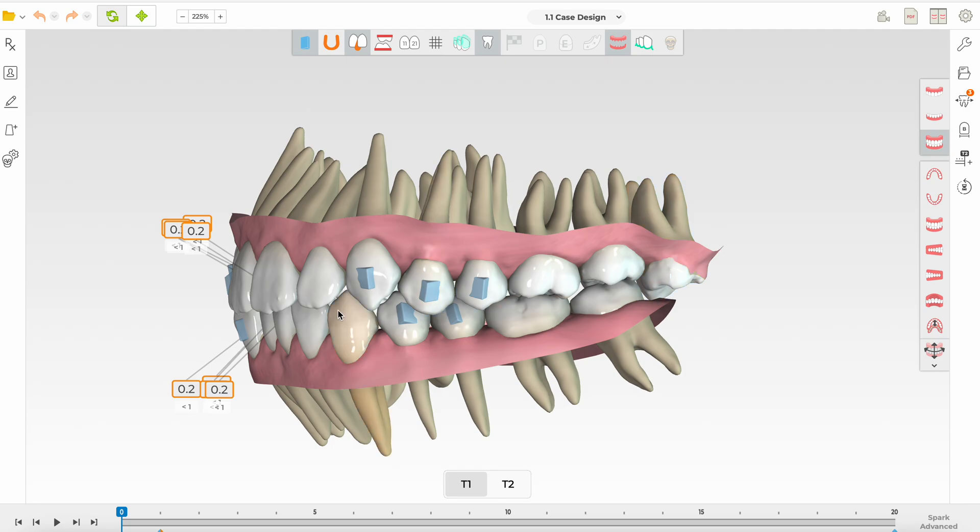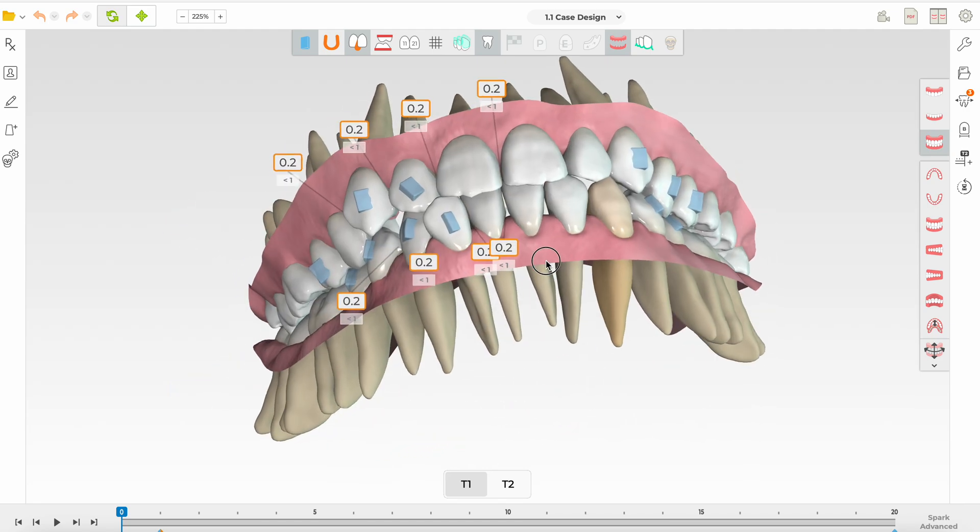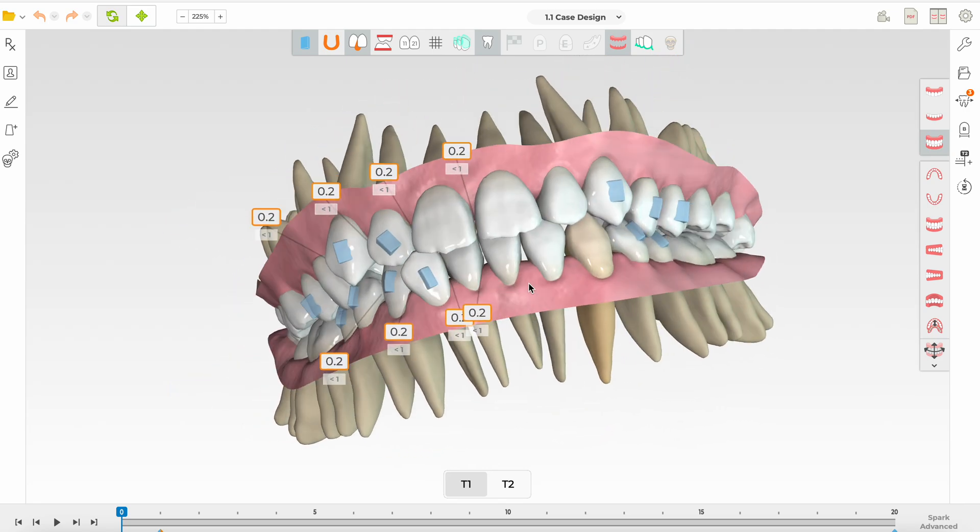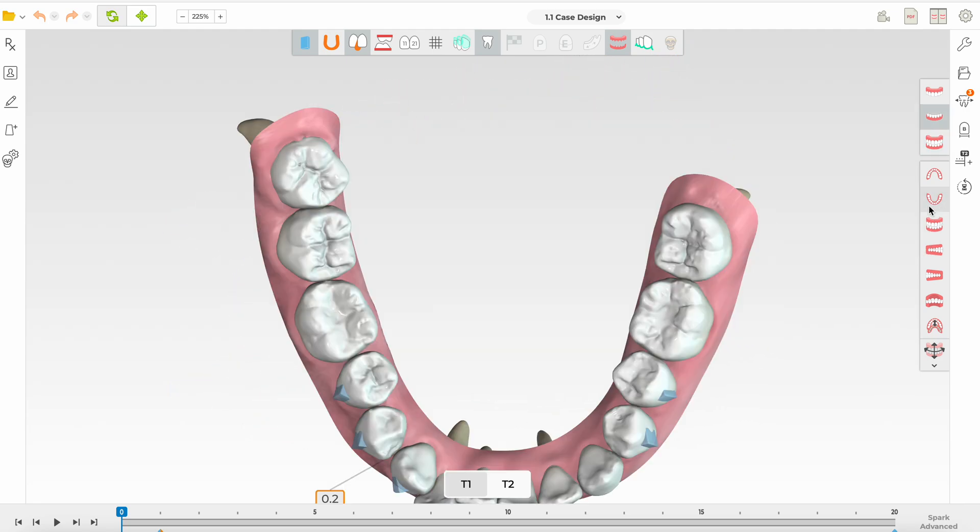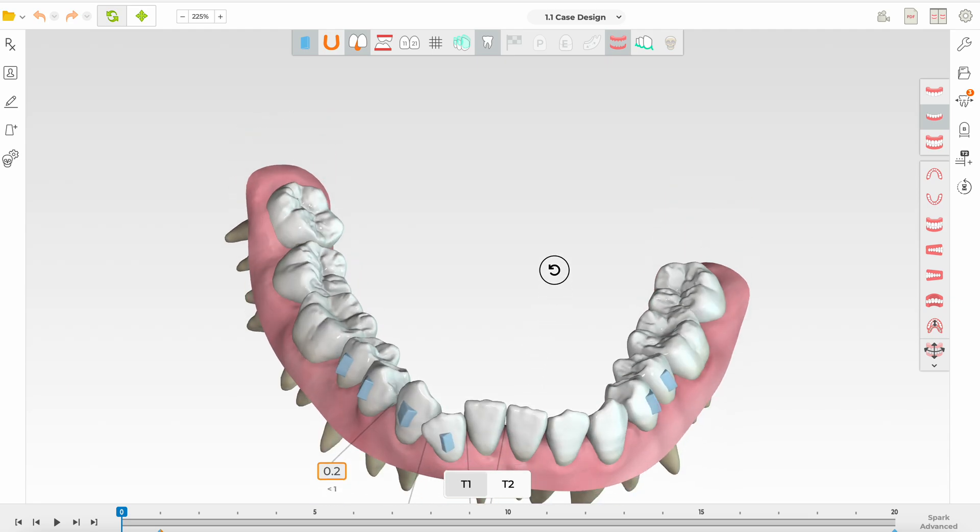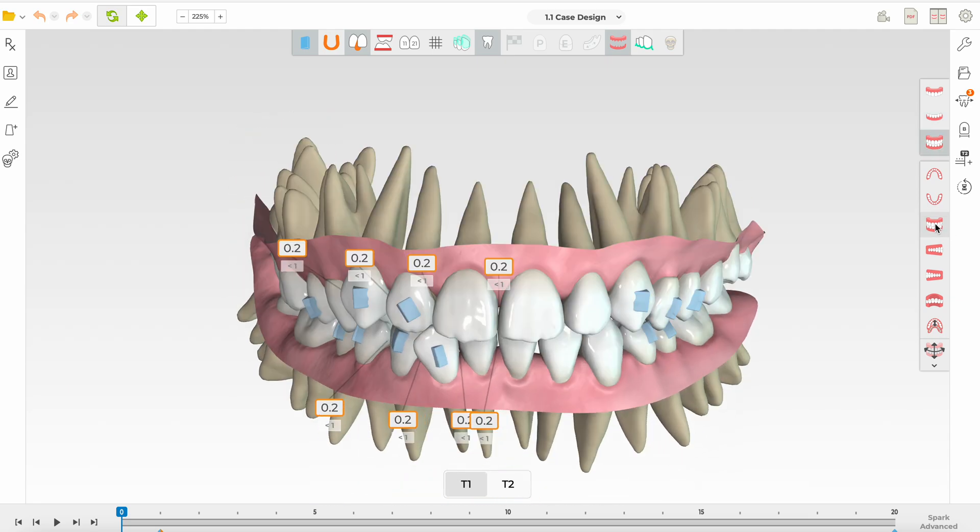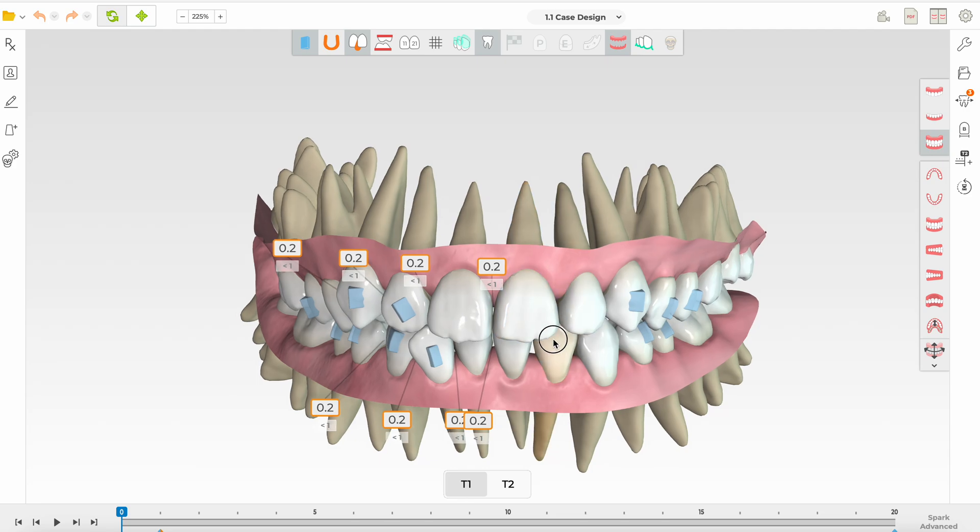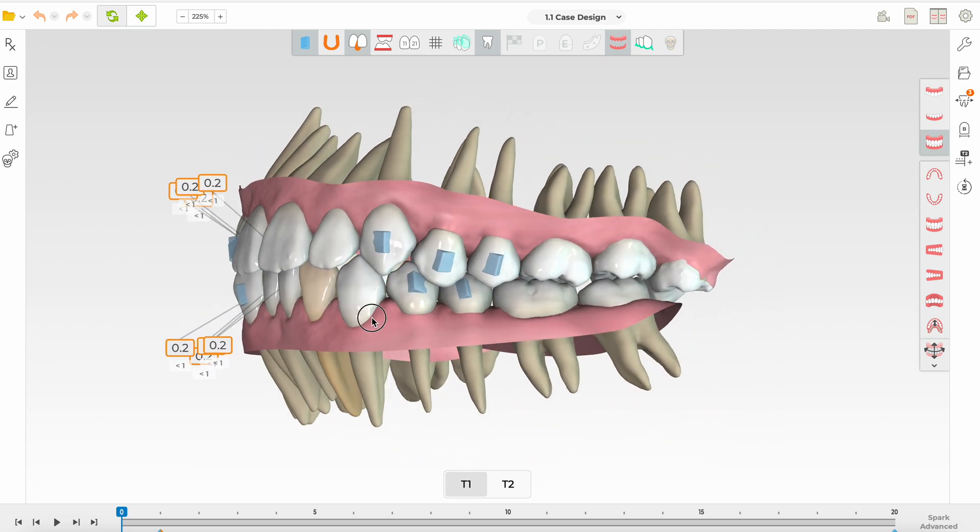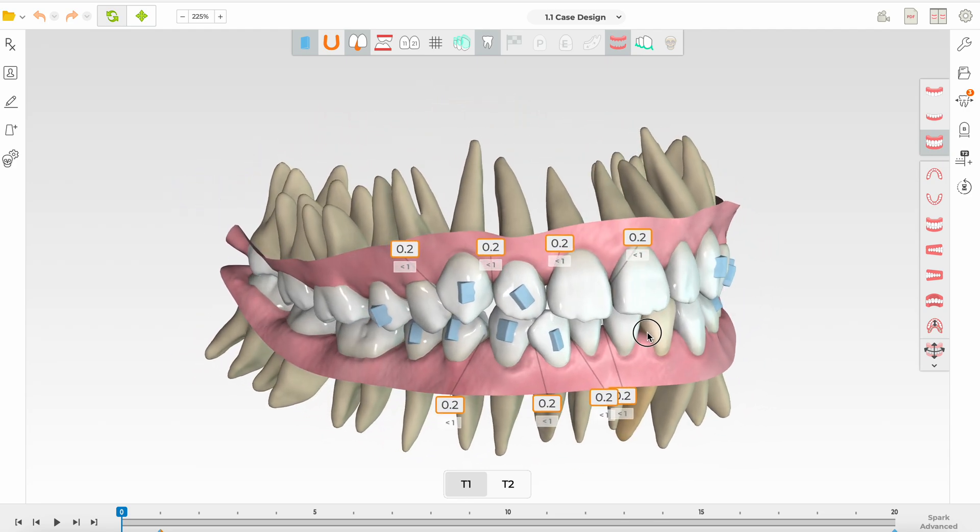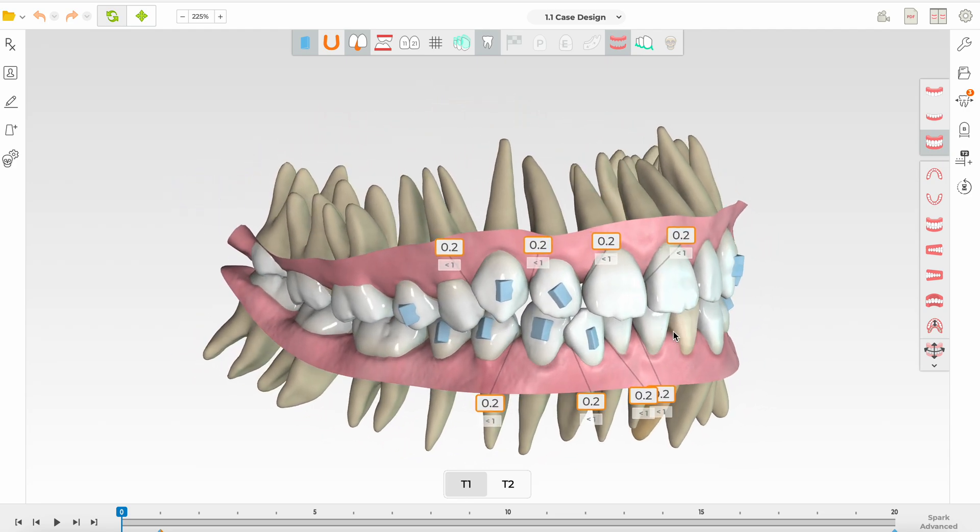We've even got a super erupted 28 and you can see that lower incisor quite blocked out here. The other thing is the patient is an adult with some recession and also some bimax protrusion. The lips are pretty protrusive. We have that typical Asian ethnicity with moderate crowding, bimax protrusion, and some recession you can already see here on the incisors.